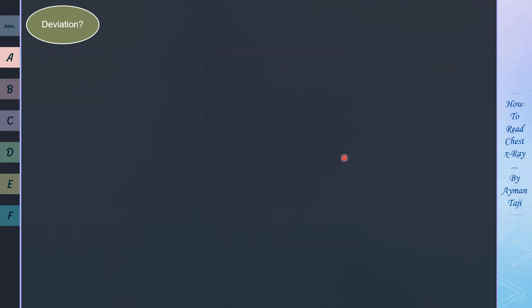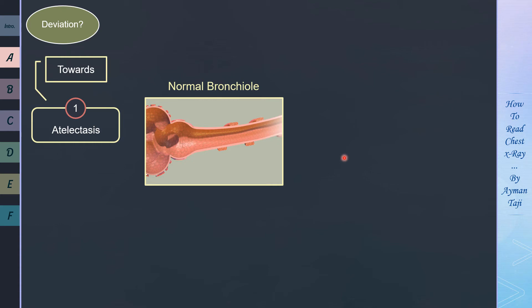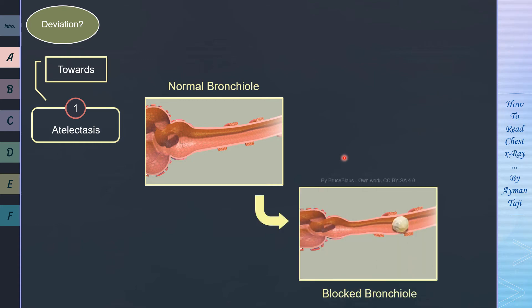On the other hand, some cases will lead to tracheal deviation towards the affected side, and there are many reasons. One of them is atelectasis, which is a loss of lung volume that is caused by a variety of ventilation disorders such as a tumor mass obstructing the airways. So if this is a normal airway, then when it's obstructed by a foreign body or malignancy, the alveoli after the obstruction won't be ventilated and gas here will be reabsorbed, which leads finally to lung collapse.